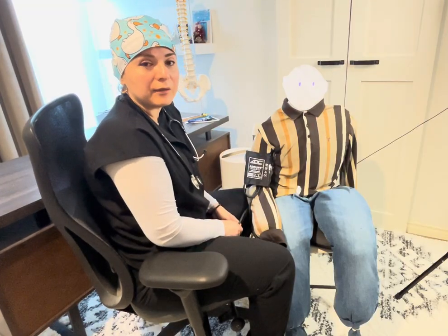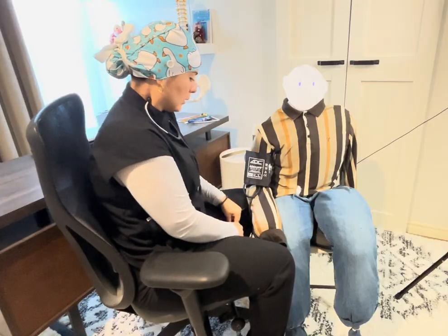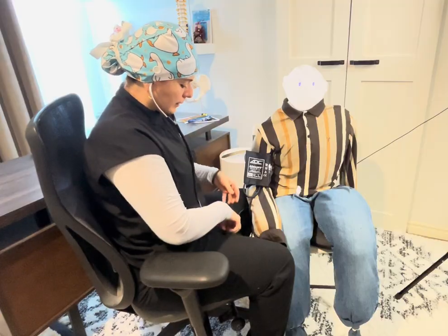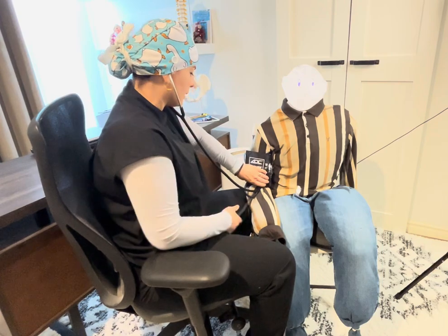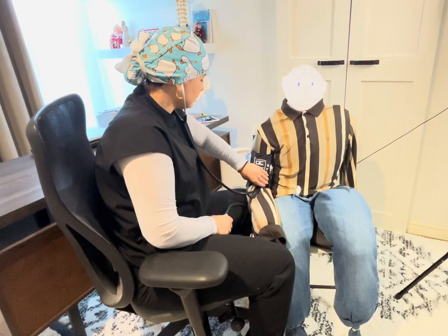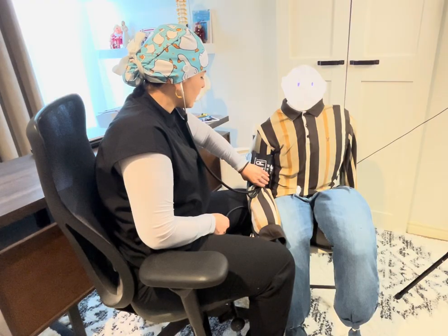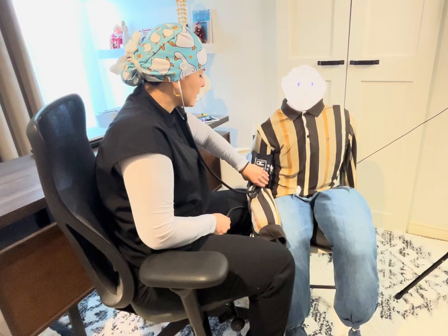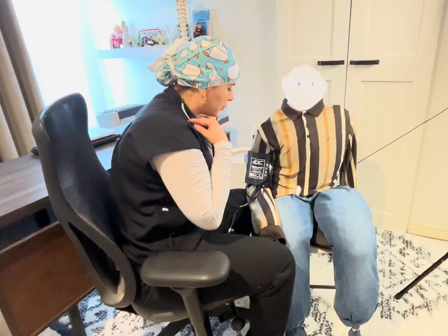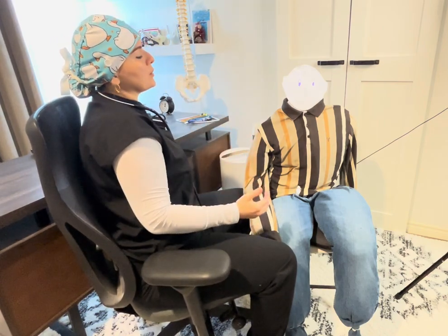Whatever number you get, add 30 mmHg on top of that when performing the actual blood pressure check. Now use the stethoscope, placing the diaphragm at the medial side of the brachial artery, and inflate the cuff — in this case, all the way to 130. Then deflate: the very first sound you auscultate is the systolic blood pressure, and the very last sound is the diastolic. Record blood pressure as even numbers — for example, 100 over 70.